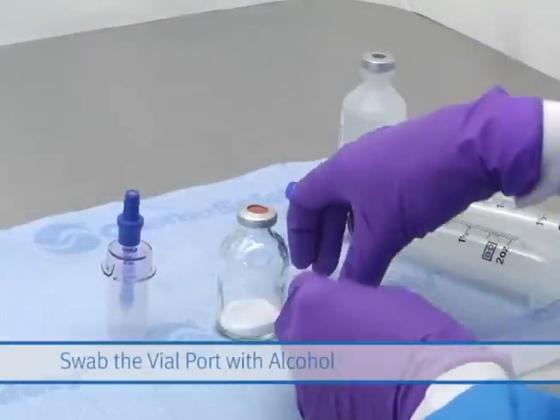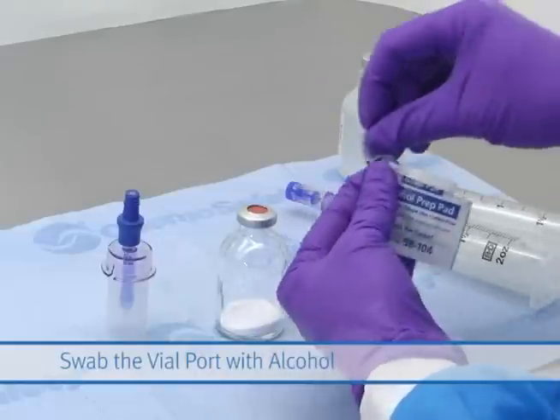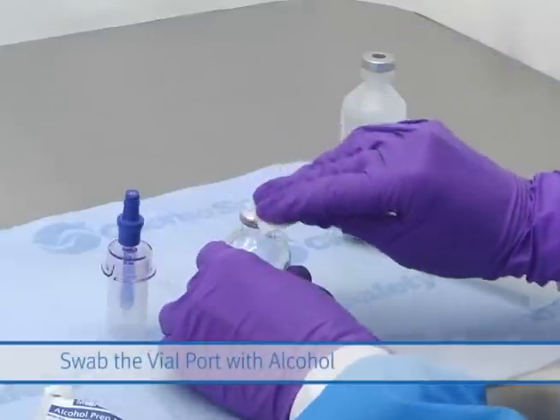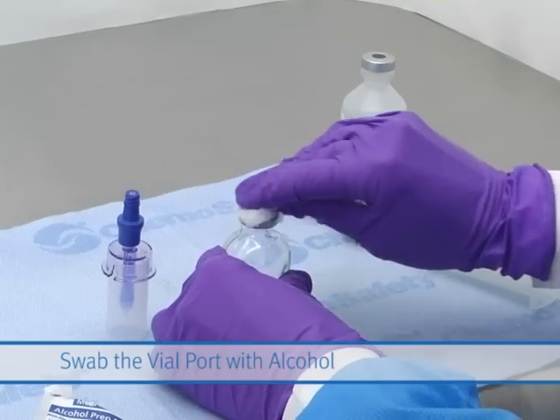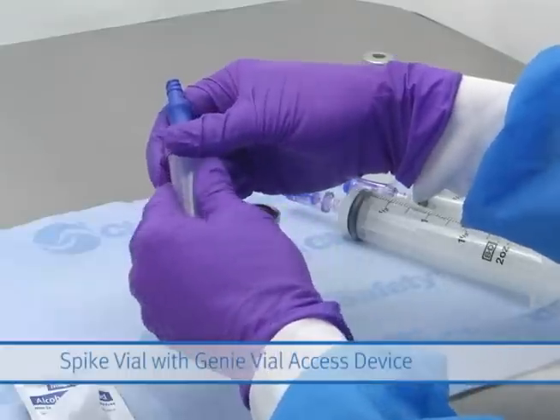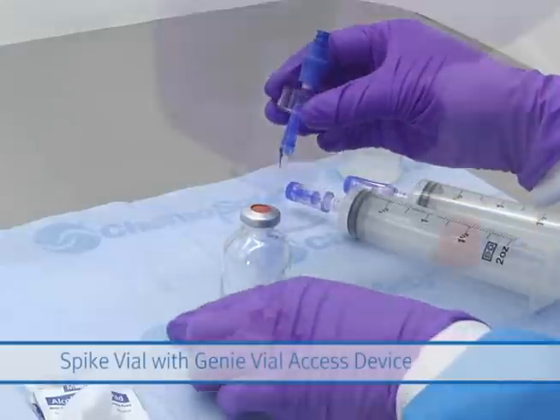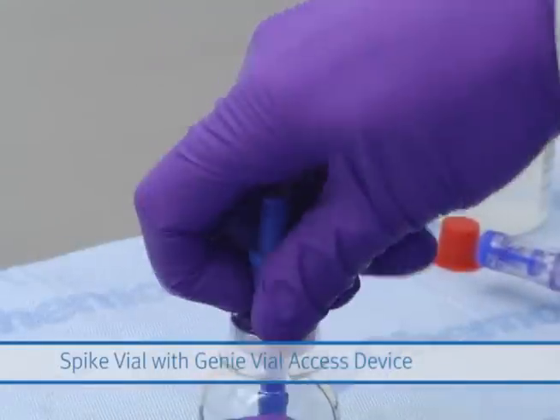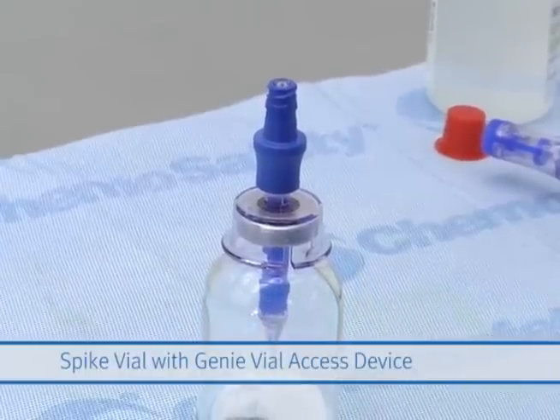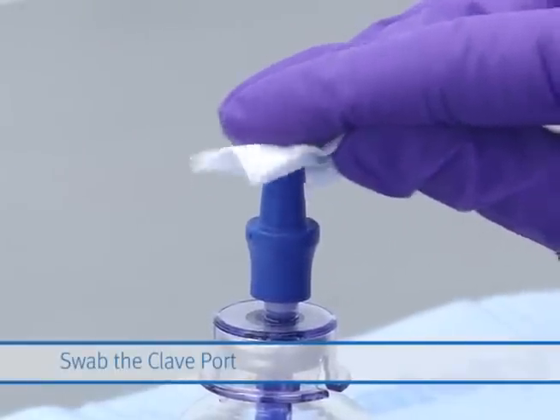Prepare the vial closure in accordance with the manufacturer's instructions. Place the vial on the counter and align the Genie spike with the center of the vial closure. Keeping the Genie as straight as possible, push down firmly into the vial until the spike passes through the stopper and the Genie skirt snaps onto the vial. Swab the clave in accordance with facility protocol.